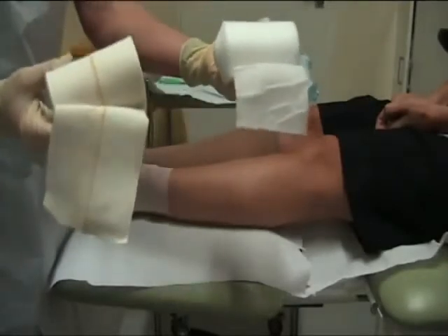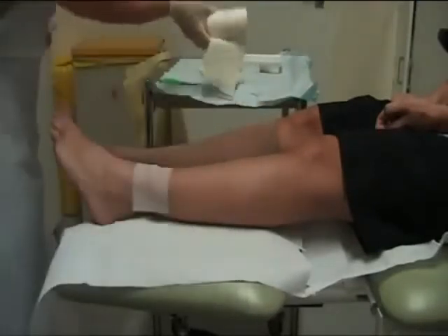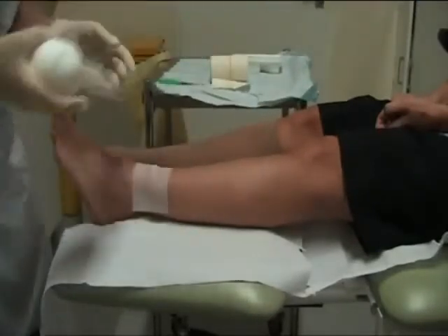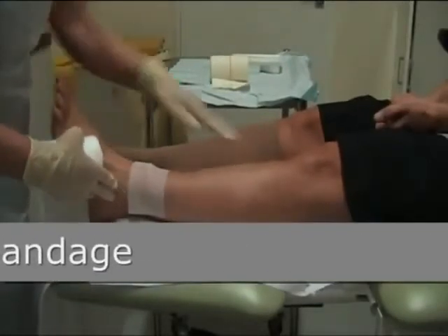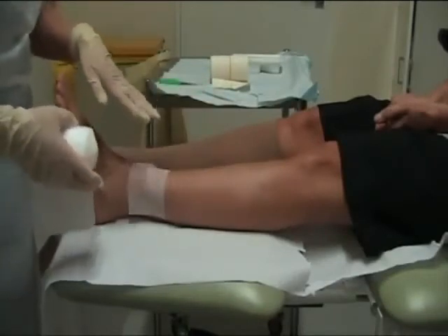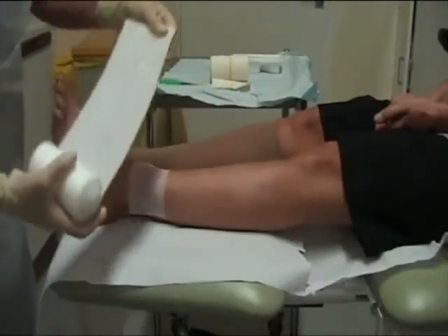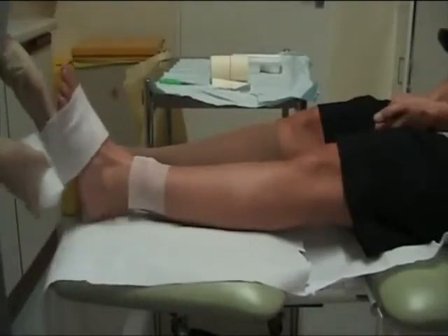The first layer is the wool layer. This is applied to the limb to protect the bony prominences of the ankle and the tibial crest. An appropriate dressing is placed over the ulcer area, and the wool bandage is applied from the base of the toes around the ankle.